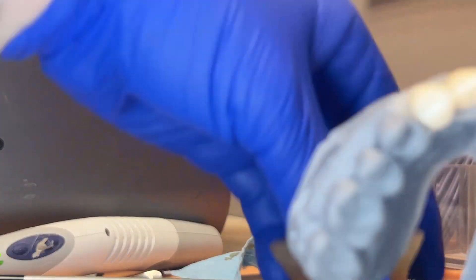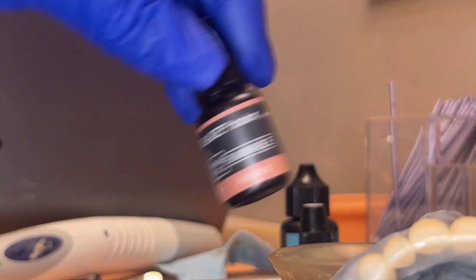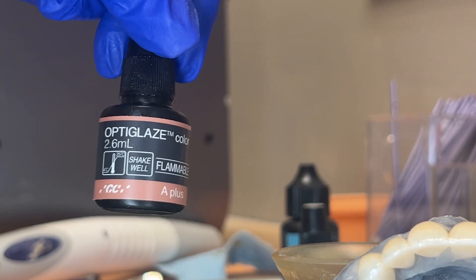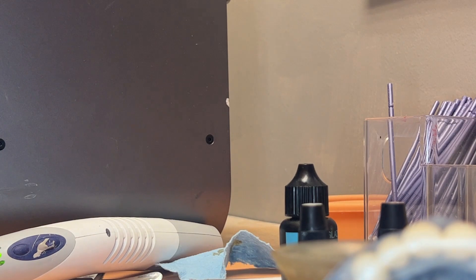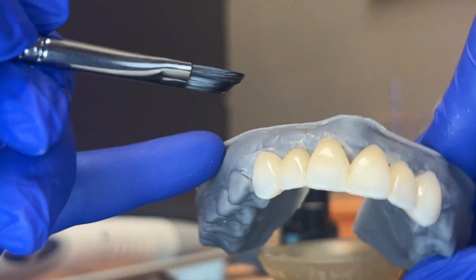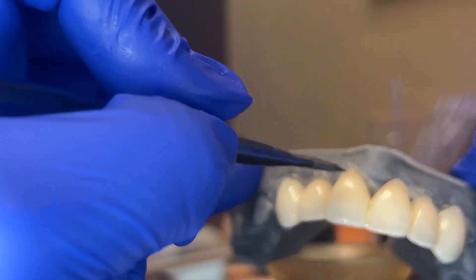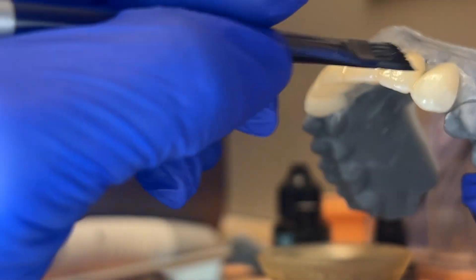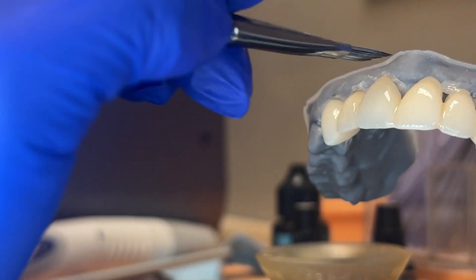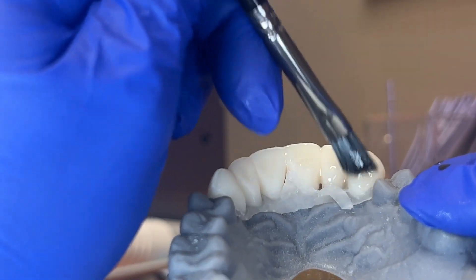For the final clear coat, you can add A-plus, B-plus, or C-plus shades if needed. For this patient I don't need to, but remember: mix your chroma down shades with white, not clear — I had been mixing mine with clear and finally found that it should be white. We're just doing clear now for the final glaze. Nice even strokes, make sure there's nothing left in the embrasures before the final cure, and don't forget the tongue side — we want it smooth to the tongue too.